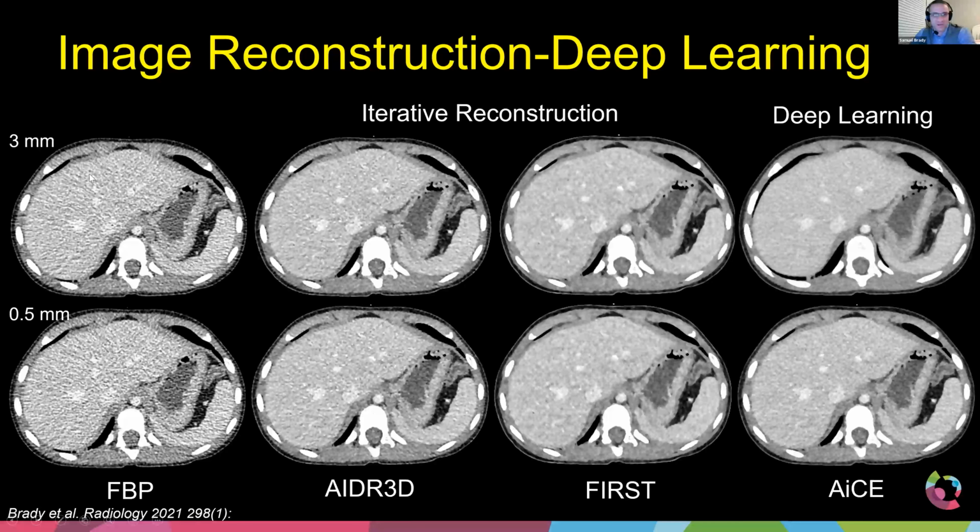And here you can see for a 3mm reconstructed image, this image right here that I'm circling with my arrow, that is what our radiologists looked at consistently for a decade, from basically 2008, 2009 up to 2019. And when we were working with Canon on developing this, we got these images here, and you can see now just the quality of the image. It's reduced in dose, and it's even improved if you look at the thinnest of images, the 0.5mm images. Yeah, still a little noisy, but compared to where it was, it's just so much cleaner.